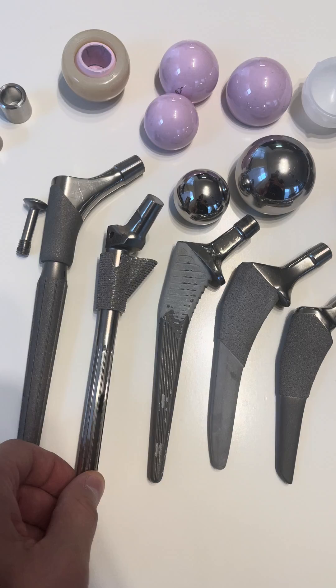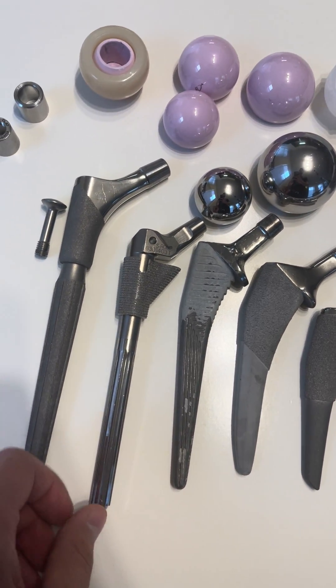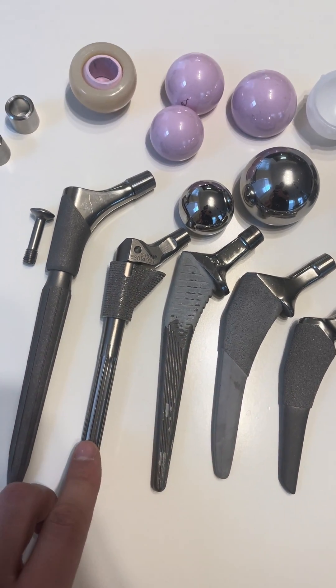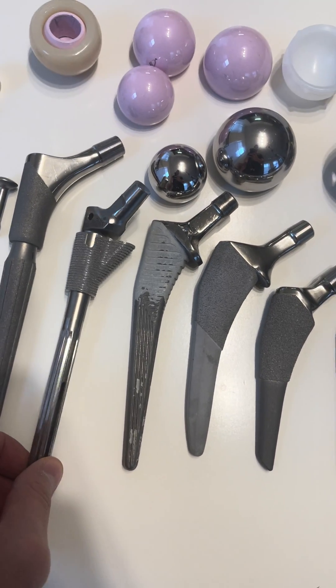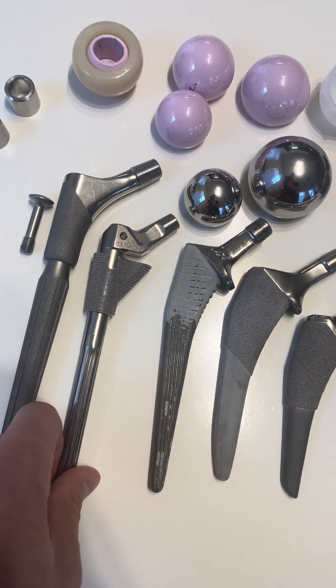This is called an SROM. You can use it for primary or revision type cases. It has a sleeve up top that's fully customizable, which allows for bone ingrowth, and distally it gets fixation with these splines to lock it into place. You can set what we call version or rotation for dysplastic hips or hips that aren't normal.